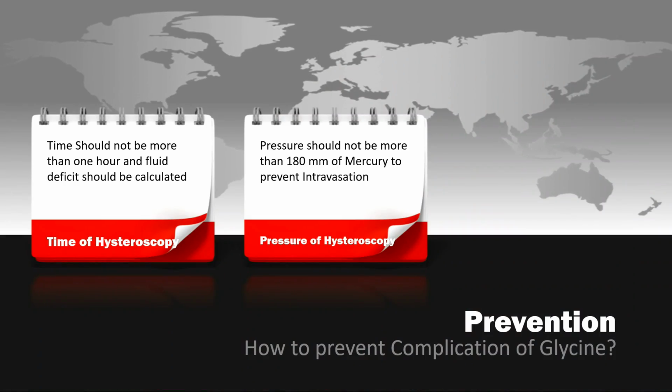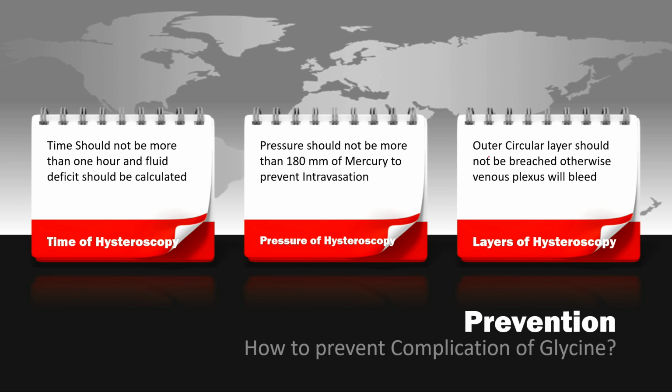And then sometime while doing, fluid is finished, and due to that air is entered in the pump, and that may create air embolism. Dangerous. So these shortcuts should not be done. Another, outer circular layer should not be breached.